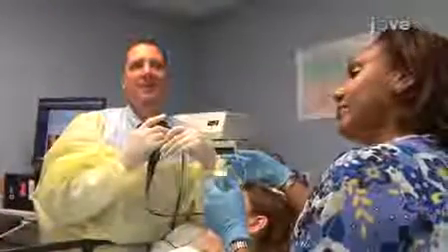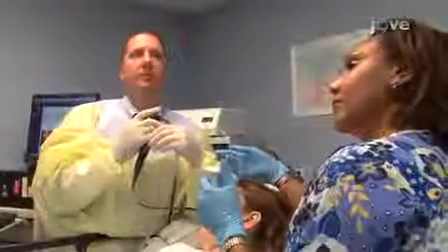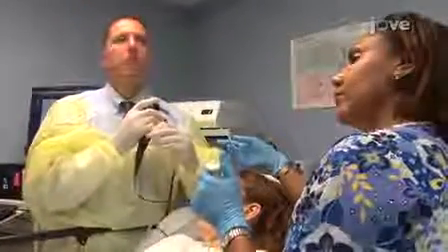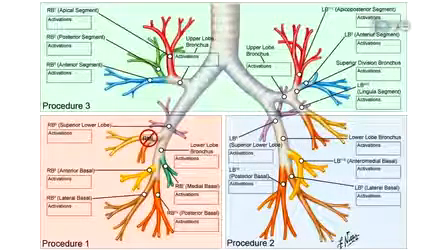A systematic approach from distal to proximal, working methodically from airway to airway across the region of the lung being treated, is recommended to ensure that all accessible airways are carefully identified and treated only once. Depending on patient size and anatomy, a range of approximately 40 to 80 activations or energy delivery cycles are performed. This technique is used in all accessible airways distal to the main stem bronchi and greater than 3 mm in diameter.